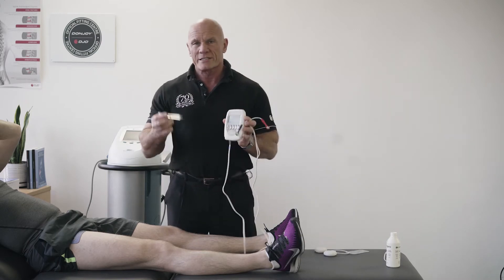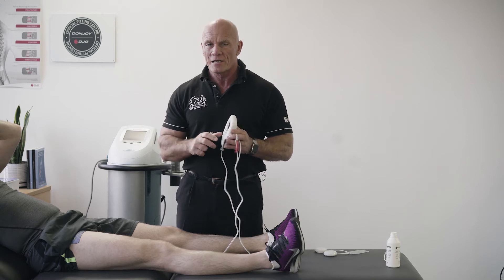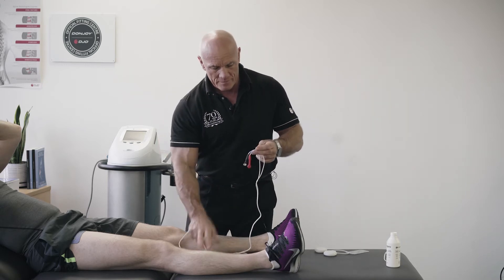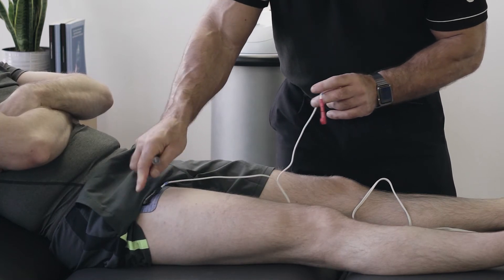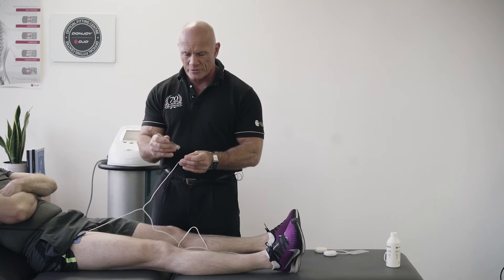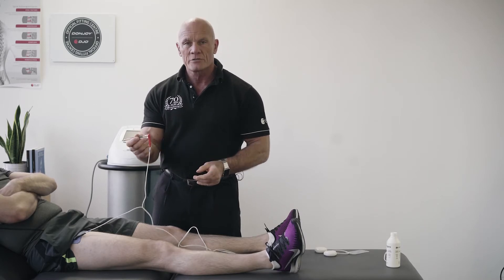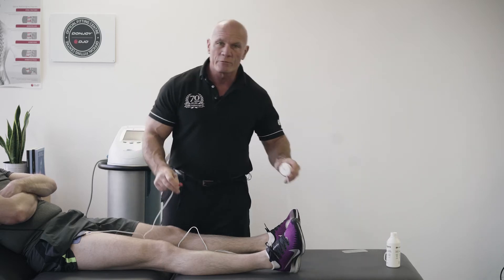With our Chattanooga device we supply a motor point pen so that we can locate these motor points. We put a reference electrode at the top of the muscle group we're looking to work, and then attach our motor point pen to the other end of the electrode. For those using wireless technology, you can still use your motor point pen by clipping it into the wireless pod.